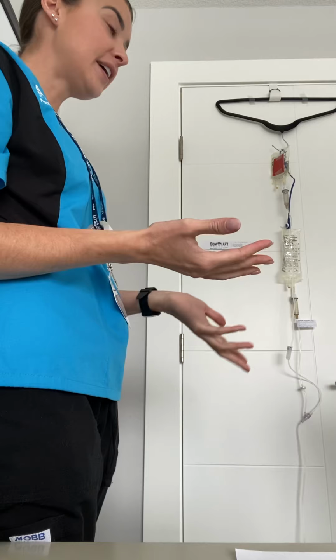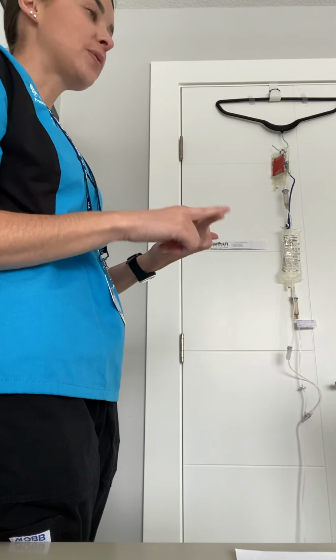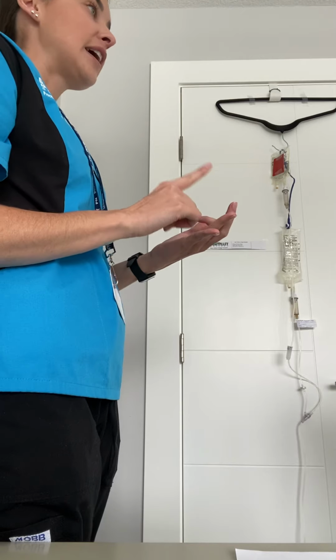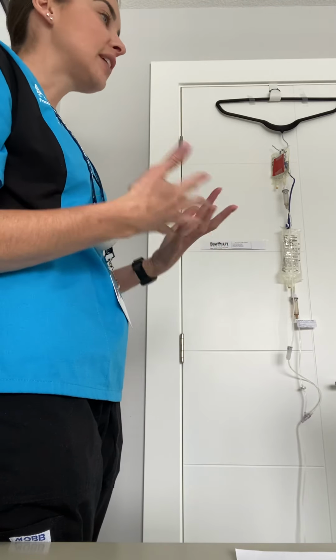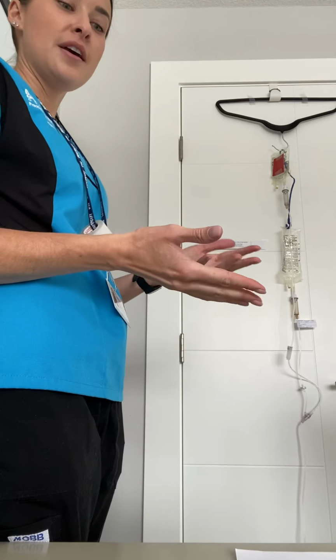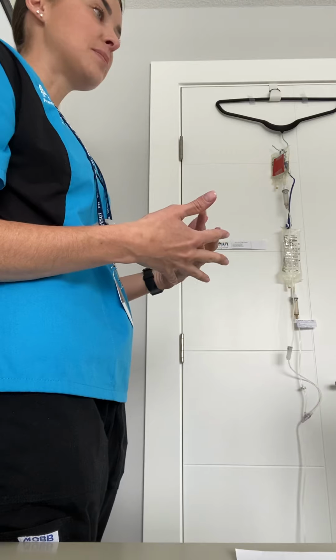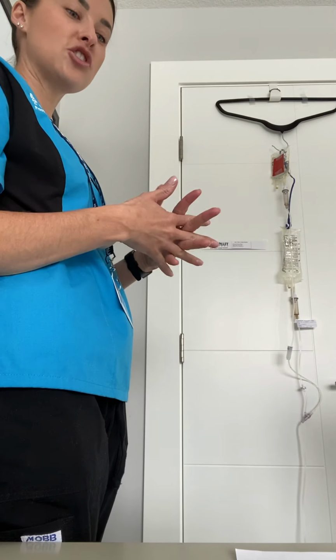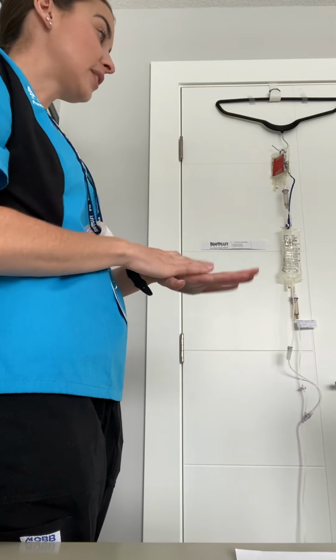So again, at the IV site, we're looking for any itching or signs of infection, which could be redness, pain, itching, swelling, bruising, anything like that, and just let us know so that we can be aware of those kind of symptoms in case there is some kind of allergic reaction or infection, like I said, happening. Okay, so that just has to do with the IV site.